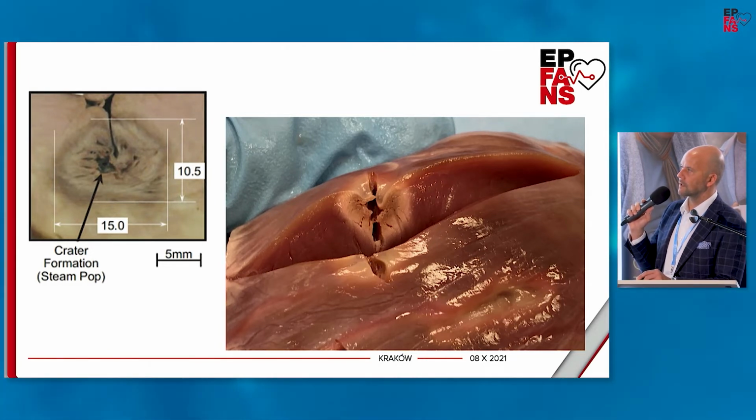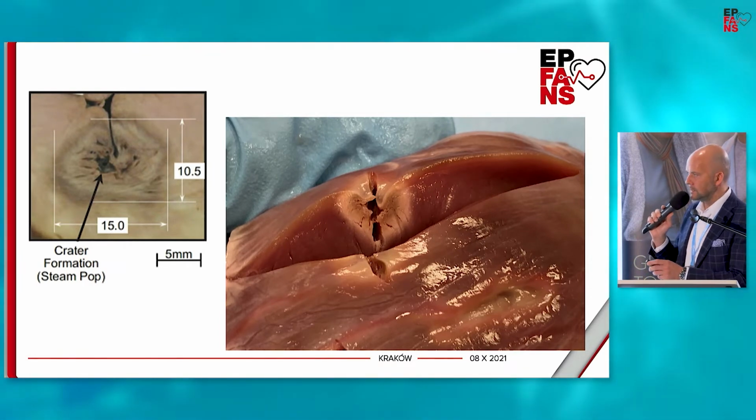Anyway, the steam pop may create a crater-like thrombogenic region.